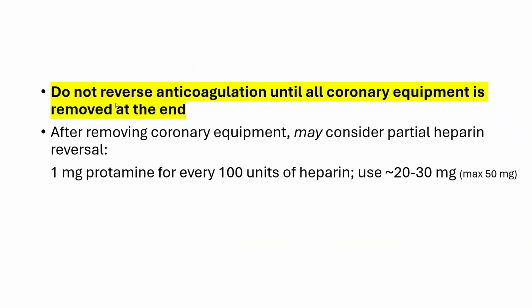As a general rule, do not reverse anticoagulation until all coronary equipment is removed at the end of the case. Otherwise, you will end up with catastrophic thrombotic complications in your coronary artery. After removing your coronary equipment and your guide, you may consider partial heparin reversal.